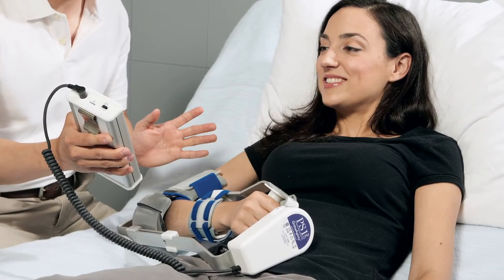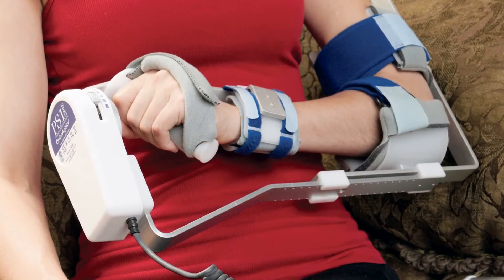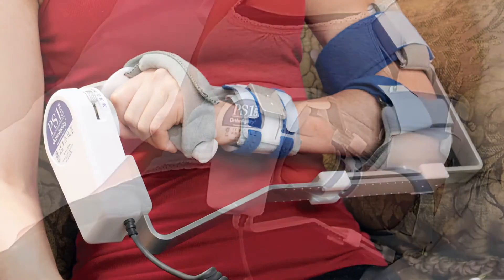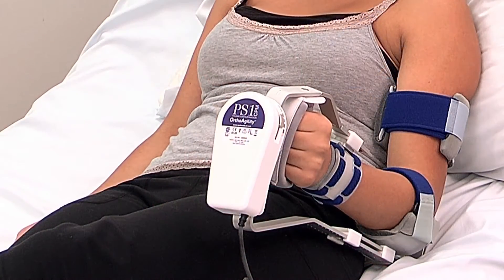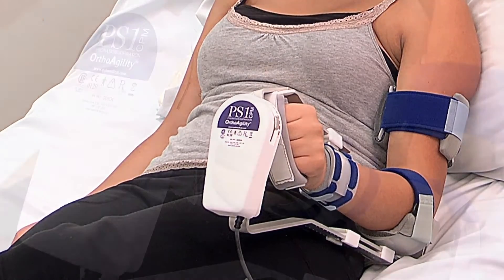The PS1 pronation supination CPM extends the benefits of continuous passive motion to the forearm. This portable device can be worn for prolonged amounts of time with its rechargeable batteries and comfortable design.